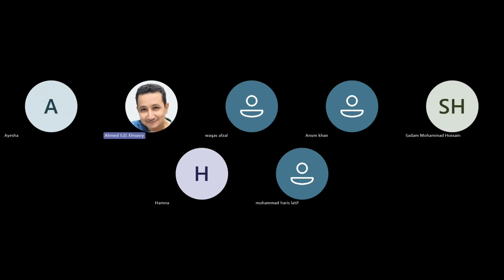But if you are in a non-urgent situation, like an elective balloon removal, where the patient is stable and not dependent on the balloon, you can remove both together. Yeah, both together. Leaving the sheath there for a longer time won't be beneficial for sterility and all. It will ultimately lead to sepsis and all, I think. Yes, correct.